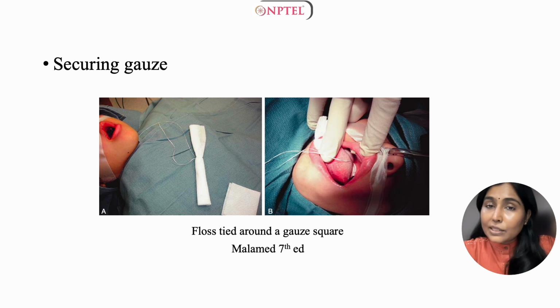Dry cotton gauze makes the tissues easier to grasp and to retract. A variety of sizes of cotton gauze are available for tissue retraction, but the most practical and the most common one is the 2 into 2 inch size. Larger 4 into 4 inch gauze squares are much preferred as they minimize the risk of aspiration of the gauze into the posterior pharynx, sometimes leading to airway obstruction.